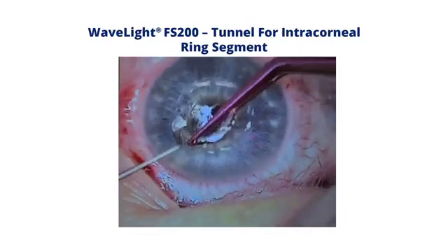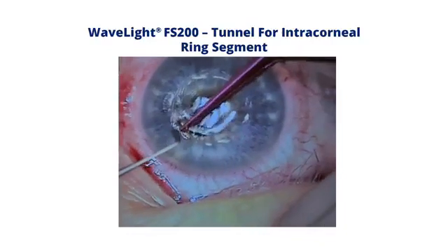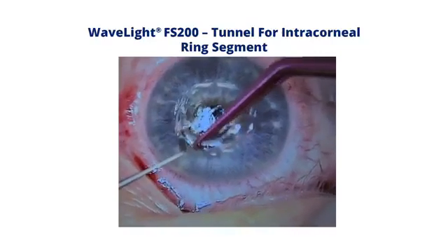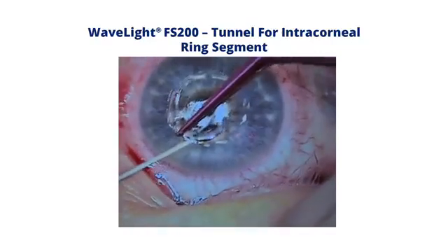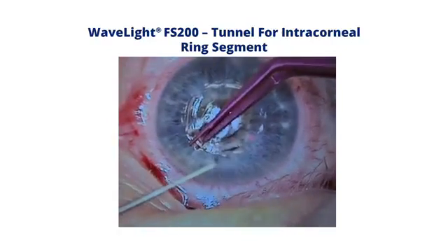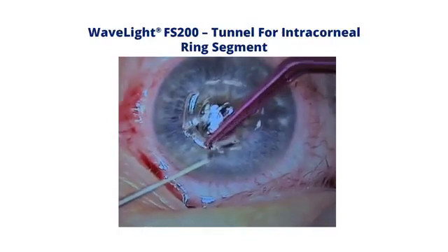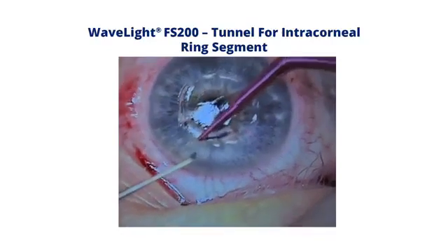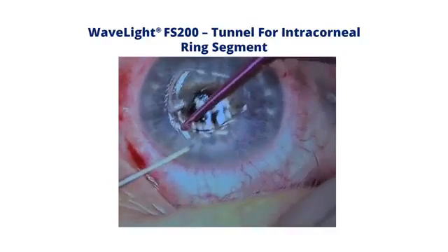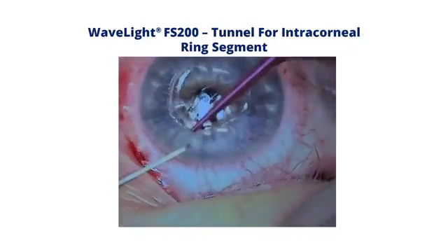And then there's a little bit of surgical geometry involved in feeding this round, because you're pushing it from above, and yet it's got to travel left to right. But that's the same with putting in any ring segment, and it just takes a little bit of practice and a little bit of patience. But the tunnel does open up beautifully.